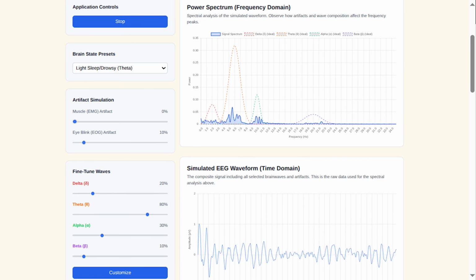Okay, and where would the electrodes normally be located? EEG electrodes are usually placed across the scalp in a standard pattern, often called the 10-20 system, covering areas like the frontal, temporal, parietal, and occipital regions. Okay, and are we only talking about surface electrodes? Yes, typically we're talking about surface electrodes placed on the scalp. There are also invasive methods, like intracranial electrodes, used in special medical cases.